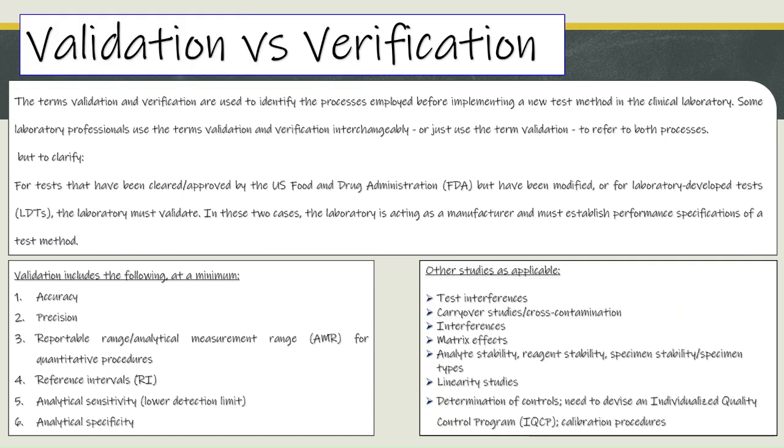Other studies as applicable: 1. Test interferences. 2. Carryover studies/cross-contamination. 3. Interferences. 4. Matrix effects. 5. Analyte stability, reagent stability, specimen stability/specimen types. 6. Linearity studies. 7. Determination of controls. Need to devise an individualized quality control program, IQCP, calibration procedures.